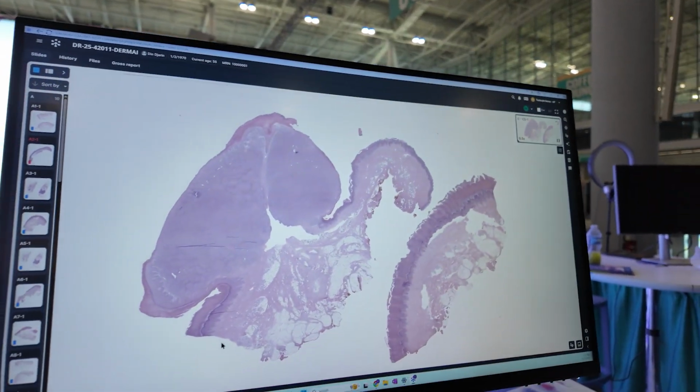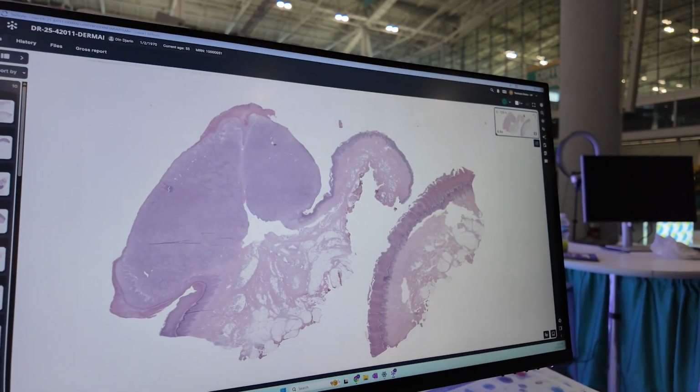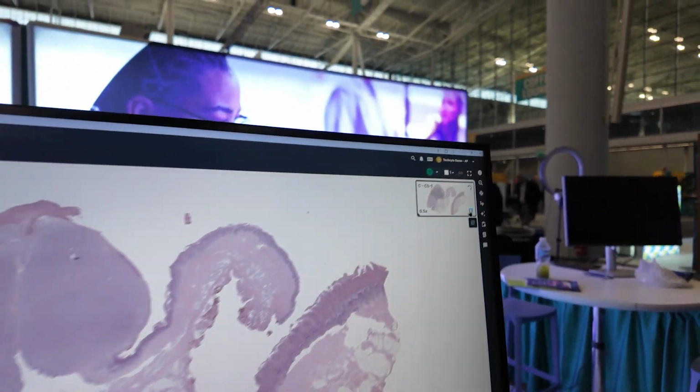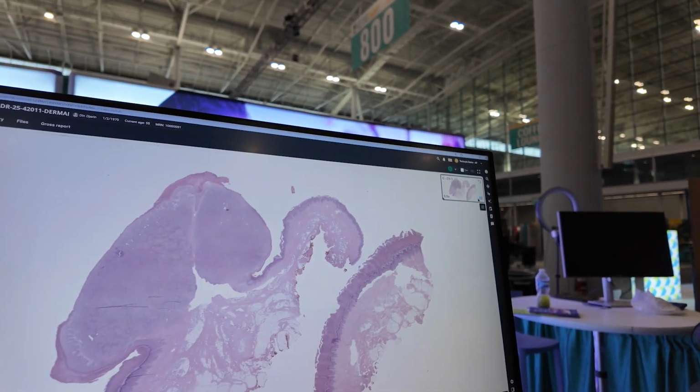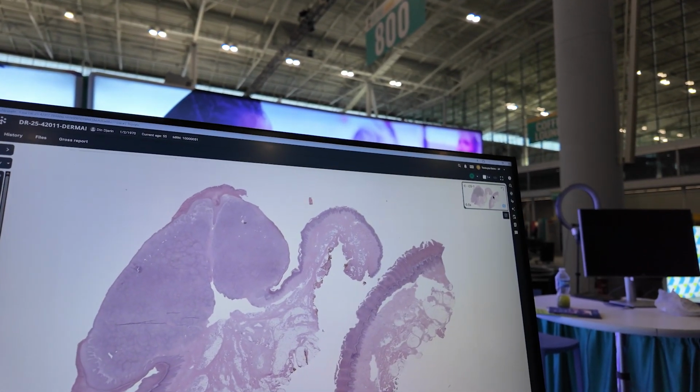And then lastly, I just want to go over the basic slide viewer navigation. So we have our mini map up here. We do tracking, heat map. I would say these are all pretty much industry standard to have. Can you do navigation on the mini map? Yeah.